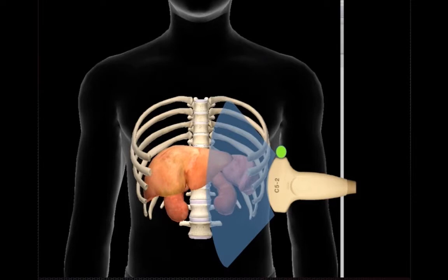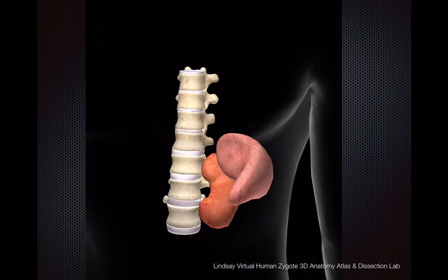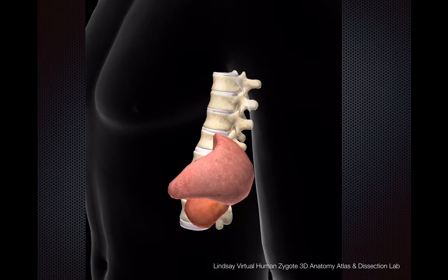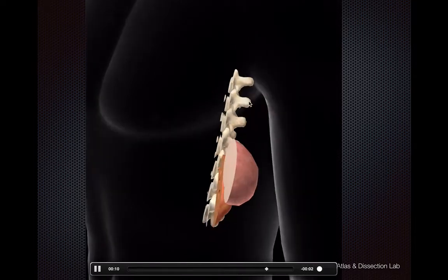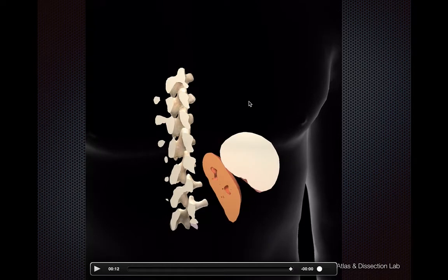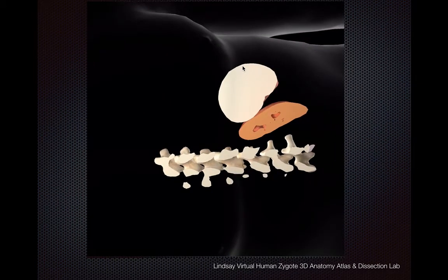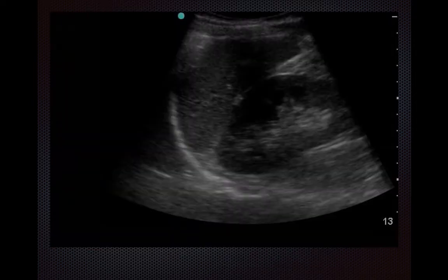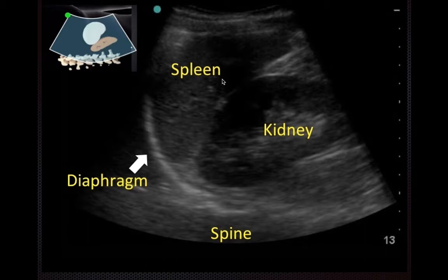In the left upper quadrant the technique is relatively similar — you point the transducer marker towards the patient's head and make a coronal slice. As you orient that view, you have your spleen, your kidney, and your spine. Rotating that to correspond to how the ultrasound image looks, with the screen marker on the left-hand side, you've got your spleen, your kidney, the spine below, and the diaphragm above — it looks remarkably similar to the right upper quadrant view, except instead of the liver you have the spleen.